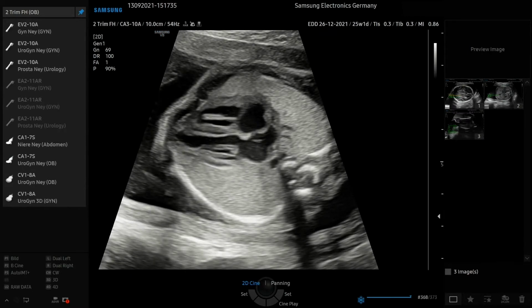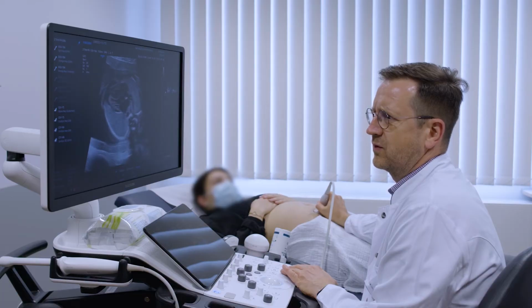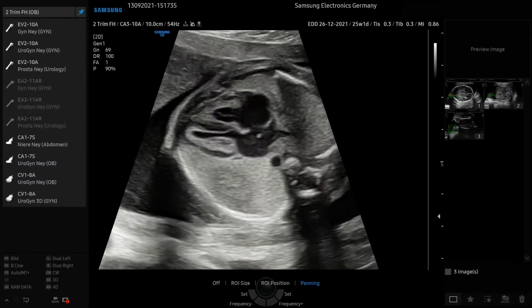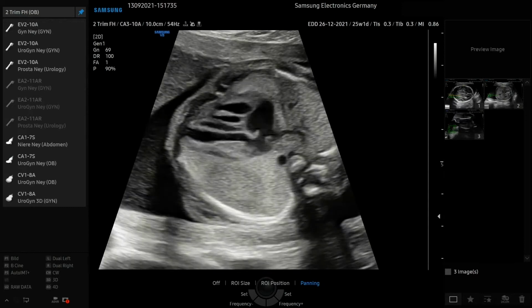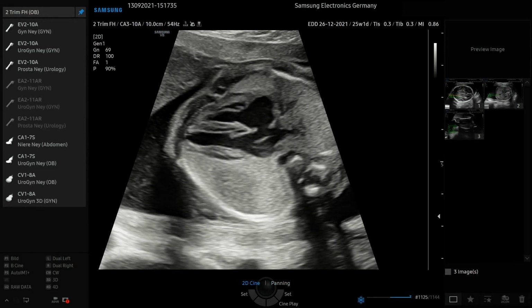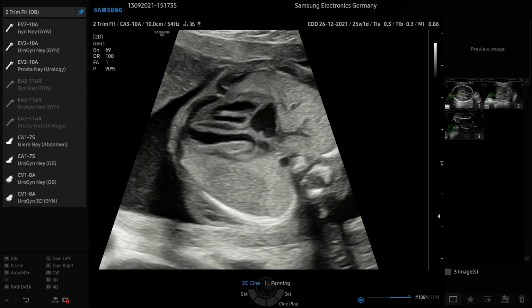This lateral view shows you the integrity of all cardiac structures which can be assessed in this view, which means this is the right side of the heart, this is the left side of the heart. You see the foramen ovale, the flap of the foramen ovale, and when we run the image again, see how the flap moves and the atrioventricular valves are arranged. You see the smooth appearance of the leaflets of the valves. You see that the valves are open here and closing here.